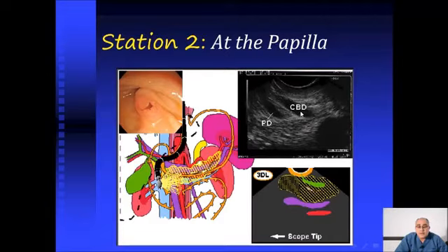The common bile duct is the tube or the channel near to the echo endoscope inside the lumen. And the second tube, which is next to the common bile duct and away from the echo endoscope, is the pancreatic duct, and of course it is slightly smaller than the common bile duct. The upper limit of the common bile duct is about 7 millimeter, and after cholecystectomy the upper limit may be up to 9 millimeter, while the upper limit of the pancreatic duct diameter is 3 millimeter in the head region, 2 millimeter in the body region, and 1 millimeter at the tail region.